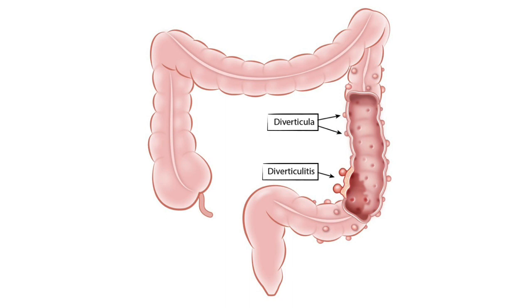So now let us look at how you identify diverticulosis when we perform either a sigmoidoscopy or a colonoscopy.